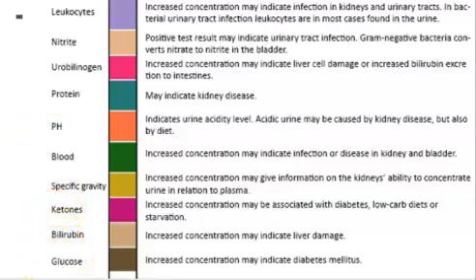The bottle that these dipsticks come in will have a scale on the side of the bottle, and you will see this in lab when we're together on campus. But the side of the bottle will have a scale that you will compare your dipstick to determine, based on color, what the test results are. You can read these dipsticks manually, looking at the scale on the side of the bottle, or we also have automated analyzers that you can stick these dipsticks in and it will read the test for you.